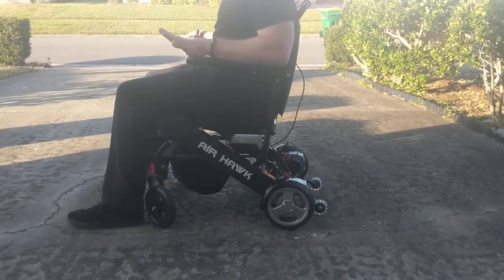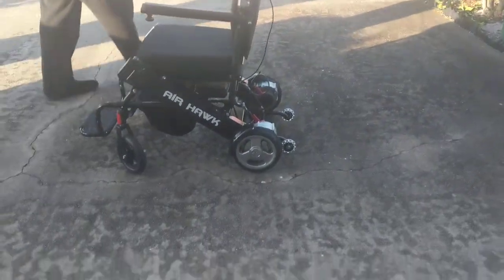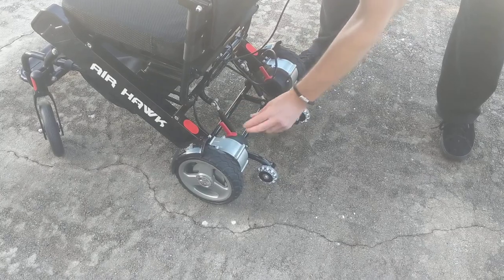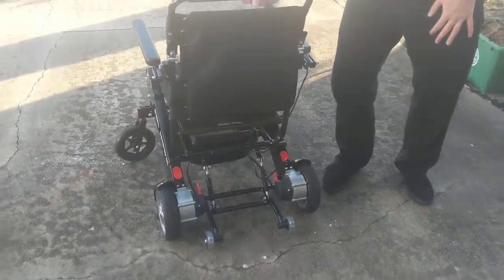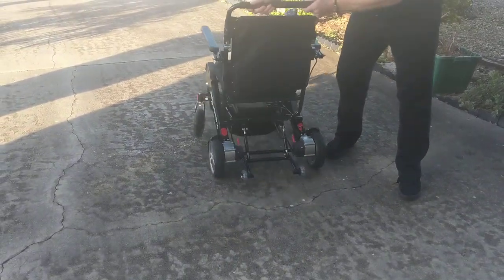In order to convert from electric to manual mode, the first step is to turn the joystick off, which we did. There are two switches in the back of the chair. The chair is now in manual mode.